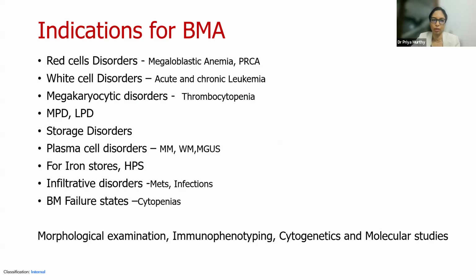We also do bone marrow aspirates for diagnosis of storage disorders to determine the iron stores and any infiltrative disorders in all bone marrow failure states like cytopenias. We do bone marrow aspirates, including morphological examination, immunophenotyping, cytogenetics, and molecular studies.